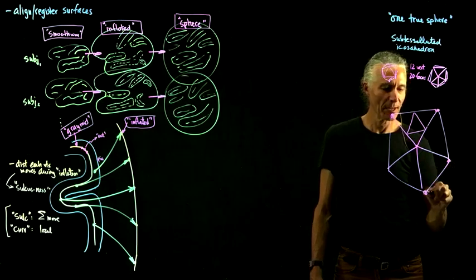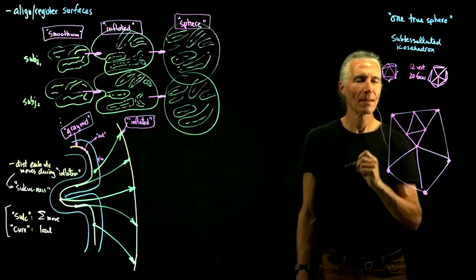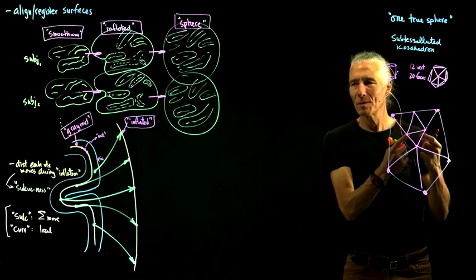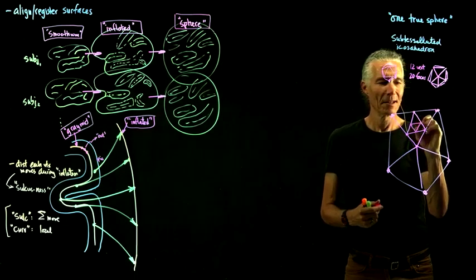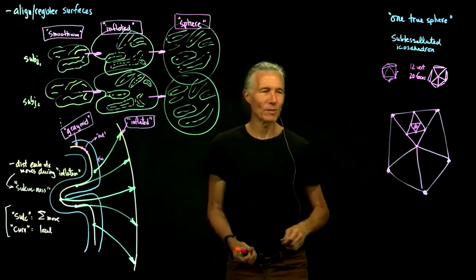You take a triangular face like that, and that gives you 3 more vertices, 4 faces, and then you can promote those vertices to touch the sphere. Then you can do that again, and again, and again. Do that 7 times, and you'll get roughly 160,000 vertices.